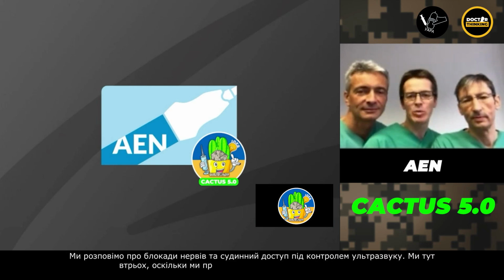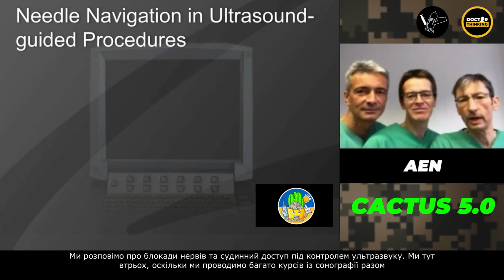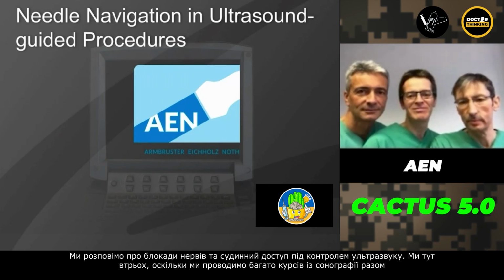Our subject today is needle tip control in ultrasound-guided interventions and procedures. So mainly we're talking about ultrasound-guided nerve blocks and vascular access. You see 3 speakers here because we are doing a lot of ultrasound courses together.